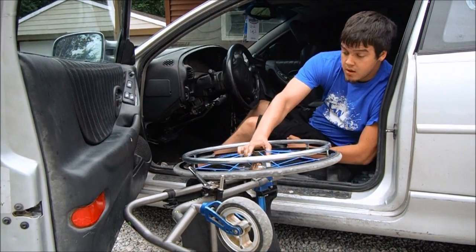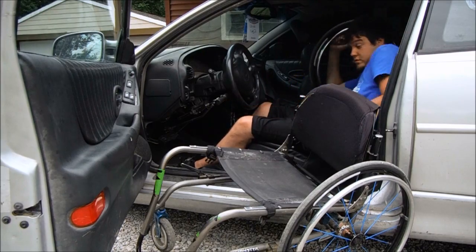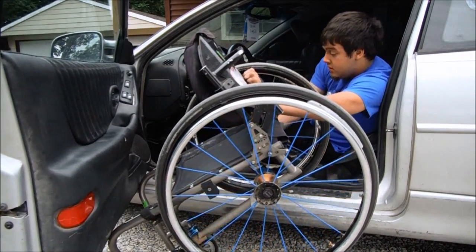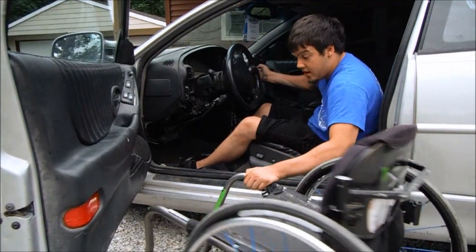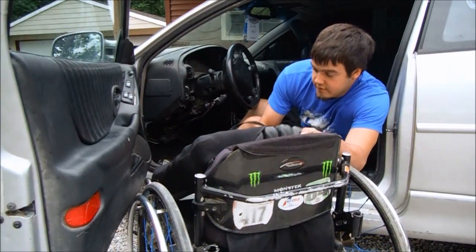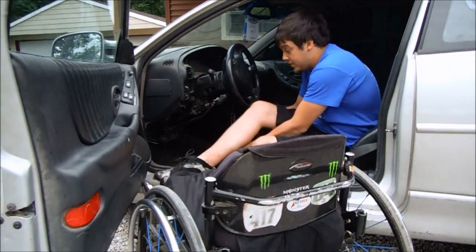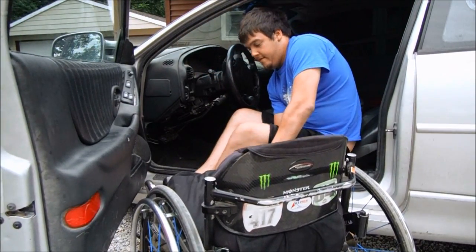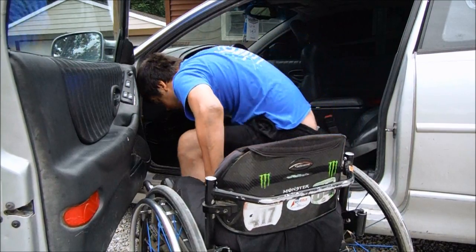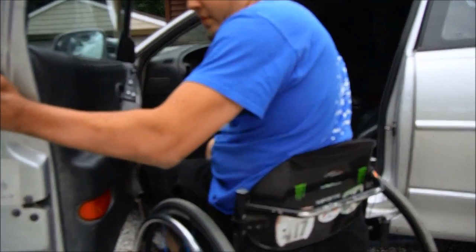Pop that wheel in, get this side ready, pop that side in. Set that where I need it, bring the cushion over, set it in place. Get my feet in place, get back to the edge, plant my feet where I need them. I go ahead and keep both feet out so they don't get caught, plant my hands, and in one swift motion — back in, get readjusted, and we're good to go.